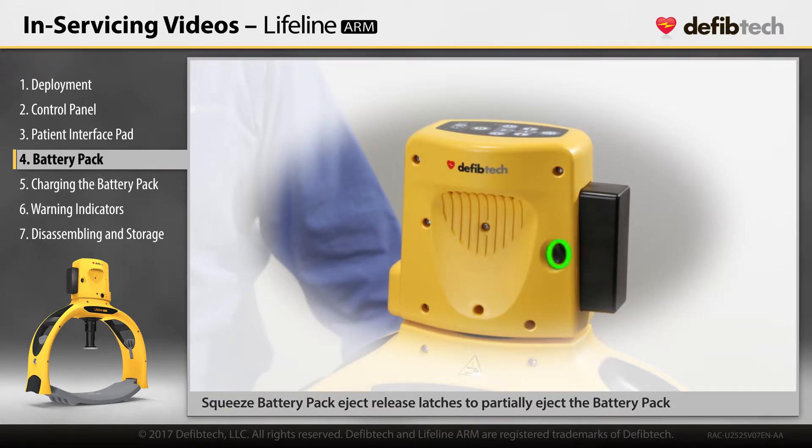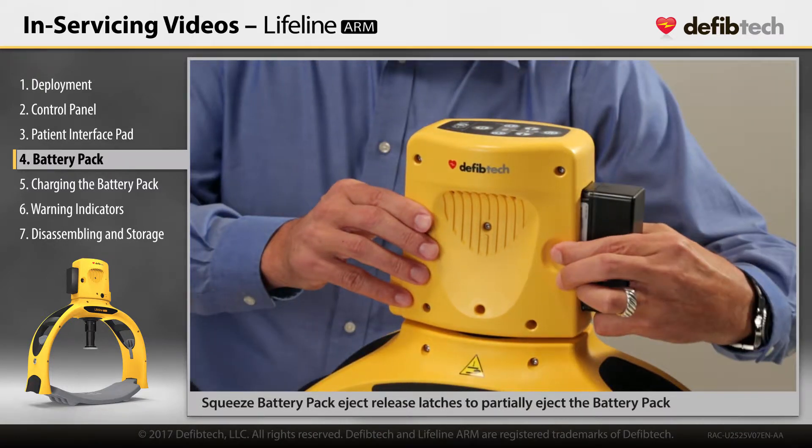To remove the battery pack, squeeze the battery pack eject release latches on either side of the battery pack opening. The battery pack will partially eject. Pull the battery pack out.